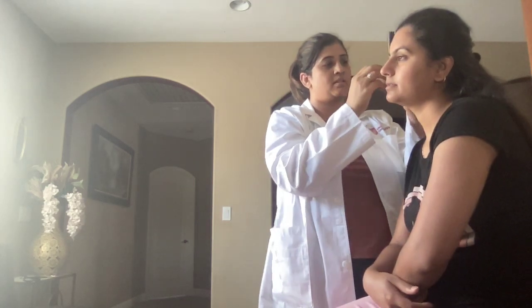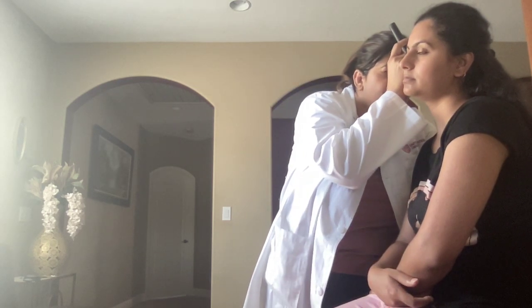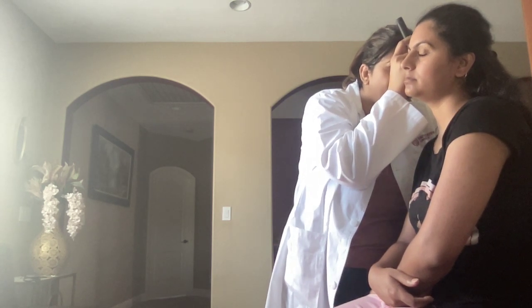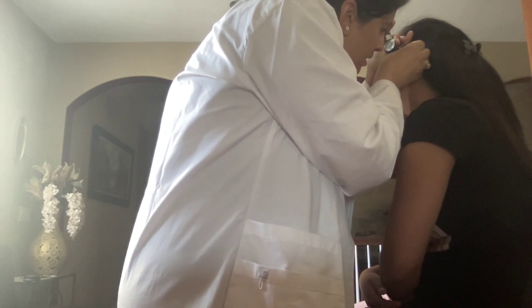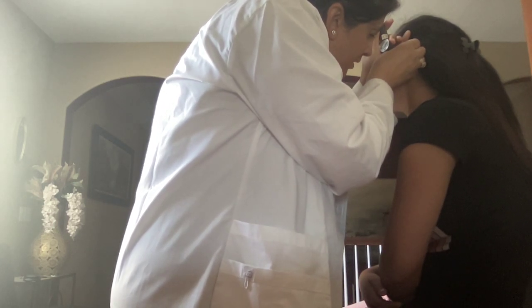Alright, checking the right ear. Okay, ear canal is clean and dry. The membranes inside have no redness. The tympanic membrane is pearly gray, and the cone of light is at 5. And then I'm going to do the same thing on the left. Ear canal is clean. Tympanic membrane is pearly gray, intact. No drainage, no exudate. And cone of light at 7.